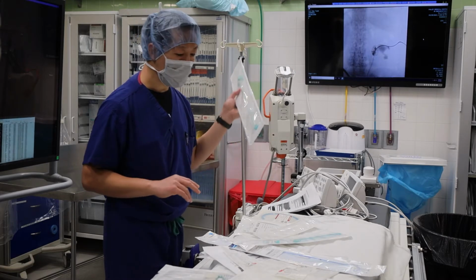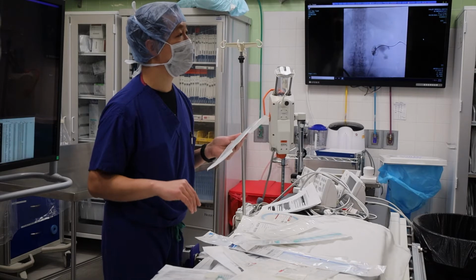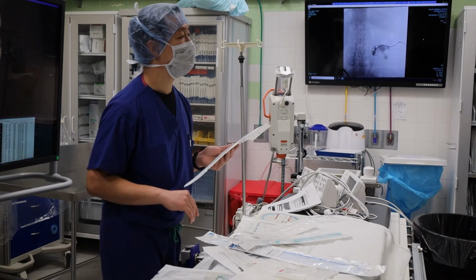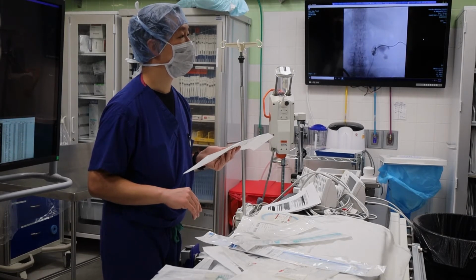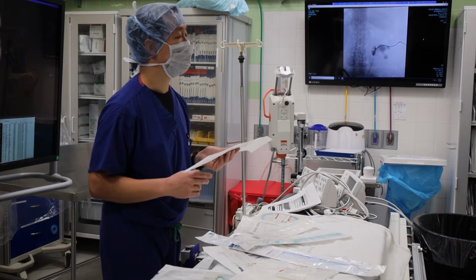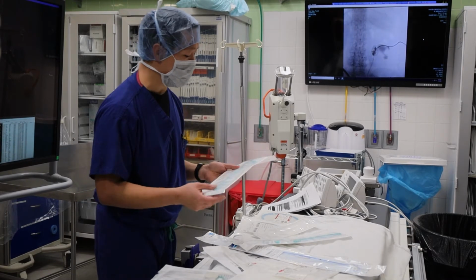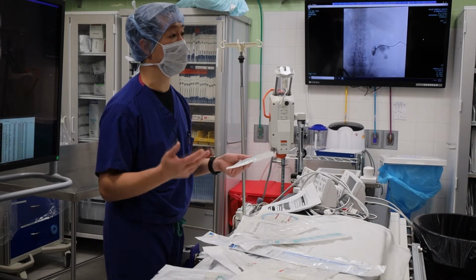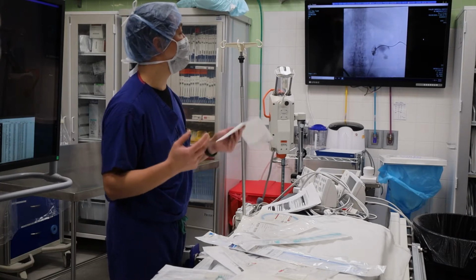Okay. Good. Do you put this to a JP bulb? Hold on. Good morning. Do you want to put this to a JP bulb or gravity bag? Gravity bag. Why? Because you're going to continuously produce urine, and it's going to be easier for the patient, for one thing. With a JP bulb, you don't need suction on this, you just need it to drain naturally. Good, right. Even if the kidney's infected like an abscess, you don't want to suck. There's several things in the body that you just don't want to put a JP on. Kidney's one of them.